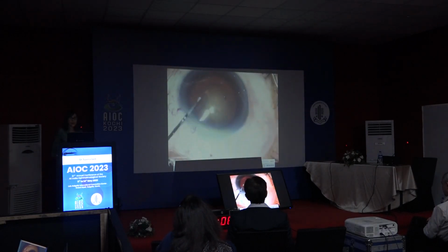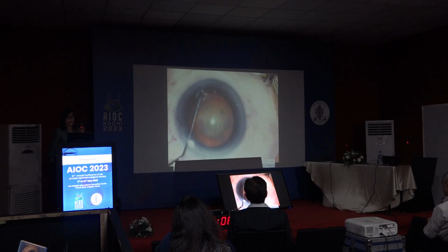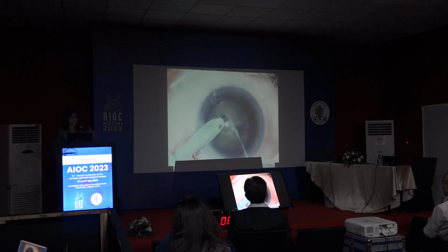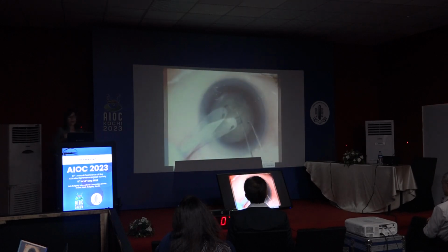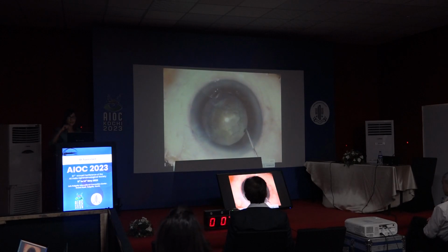This is a patient with a NS2 to 3. This again is a very old video. It's a controversial thing, but in harder cataracts, hydrodelineation is slightly more challenging. There's always a tendency of the fluid to go subcapsular. Now, the first chop seems to be going well, but there was a significant lateral separation, and you can see how the nucleus is starting to sink.